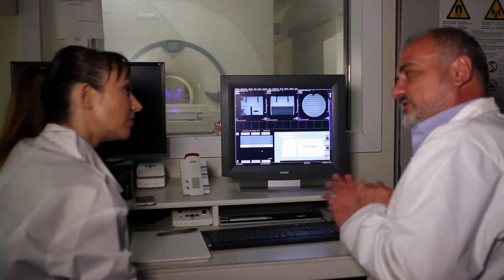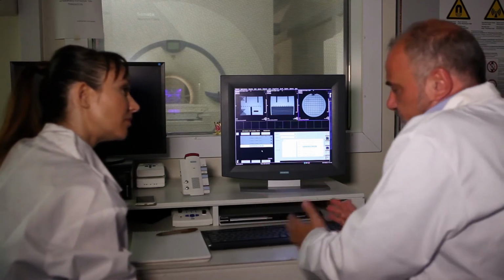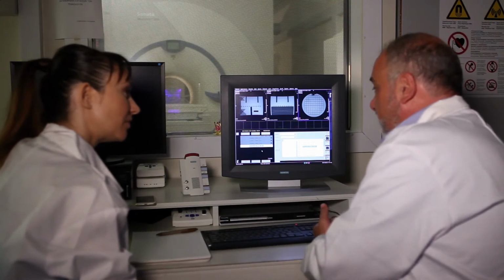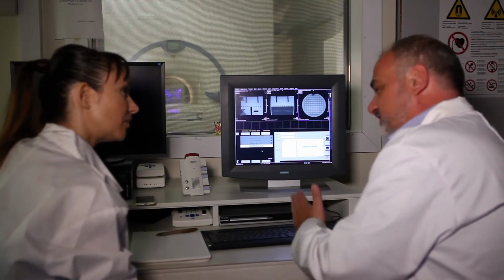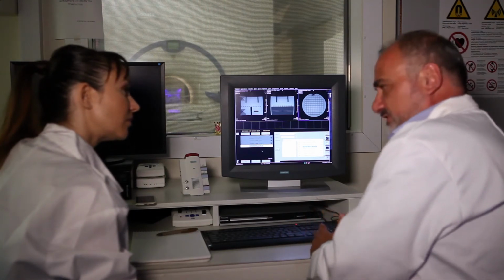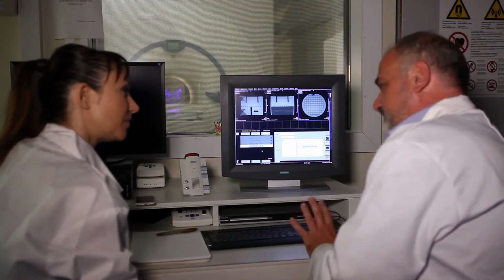That's a good idea. That's a good attitude. We do a job, and in order to do the job, we have to assign jobs to other people. For the daily quality assurance test, definitely the technologists, when the machine starts in the morning, you need only 10 minutes to do it. So that's a good issue.